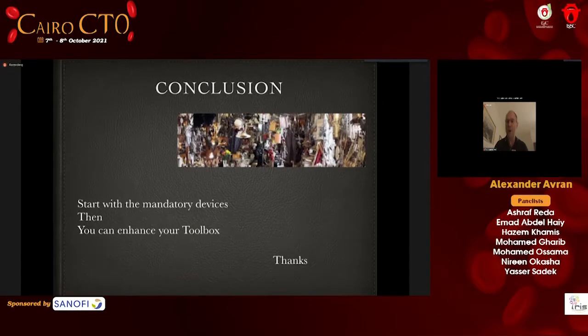If you are a retrograde operator, you have seen what you need to add. And then with your experience, maybe you can enhance your toolbox with some devices, IVUS, ADR devices. So this is my point of view. It's a very personal presentation, but I think it could also be useful for you. Thank you so much.